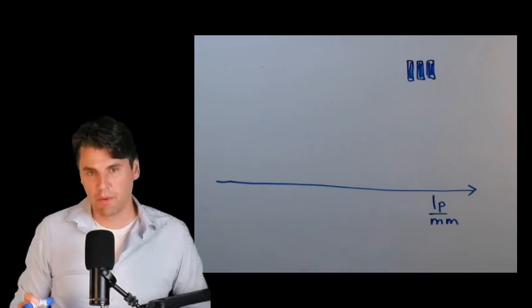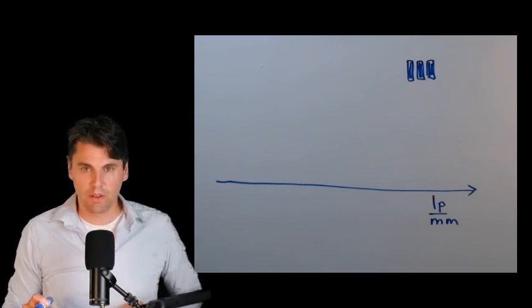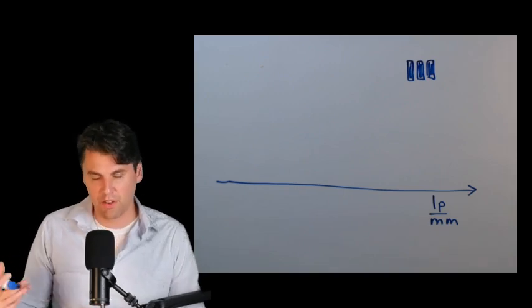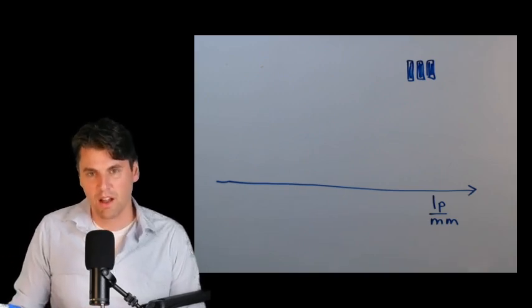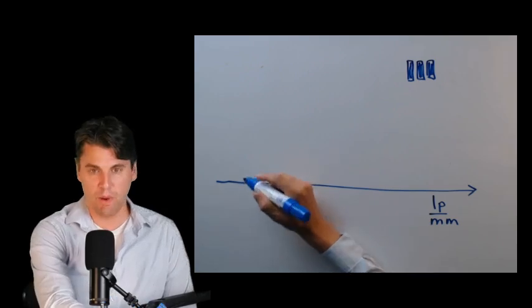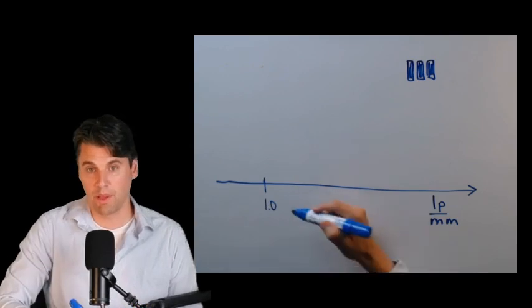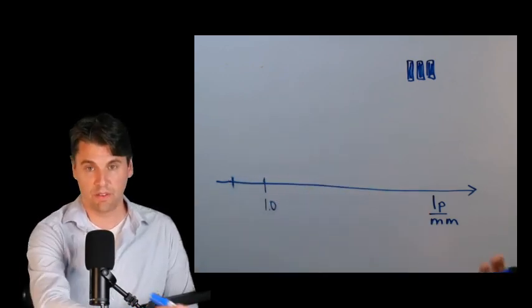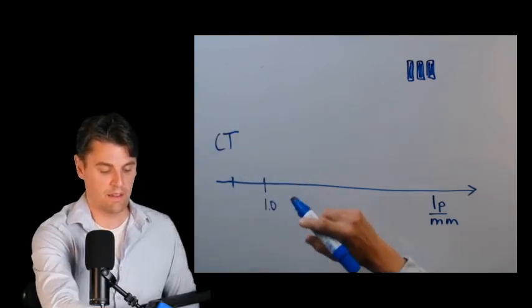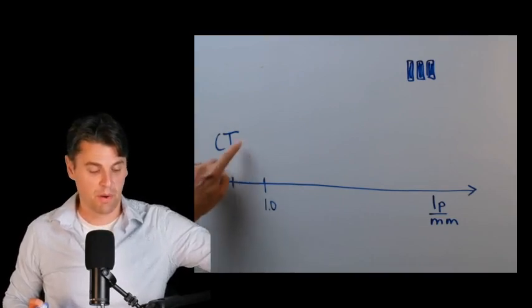On CT, with our standard imaging, where we're looking at soft tissue primarily, for the vast majority of the reconstructions done on a CT scanner, you're actually going to be way down here. If this is 1 line pair per millimeter, typically CT with the standard, soft tissue type kernel is down in here, somewhere around 0.6, 0.7 line pairs per millimeter.